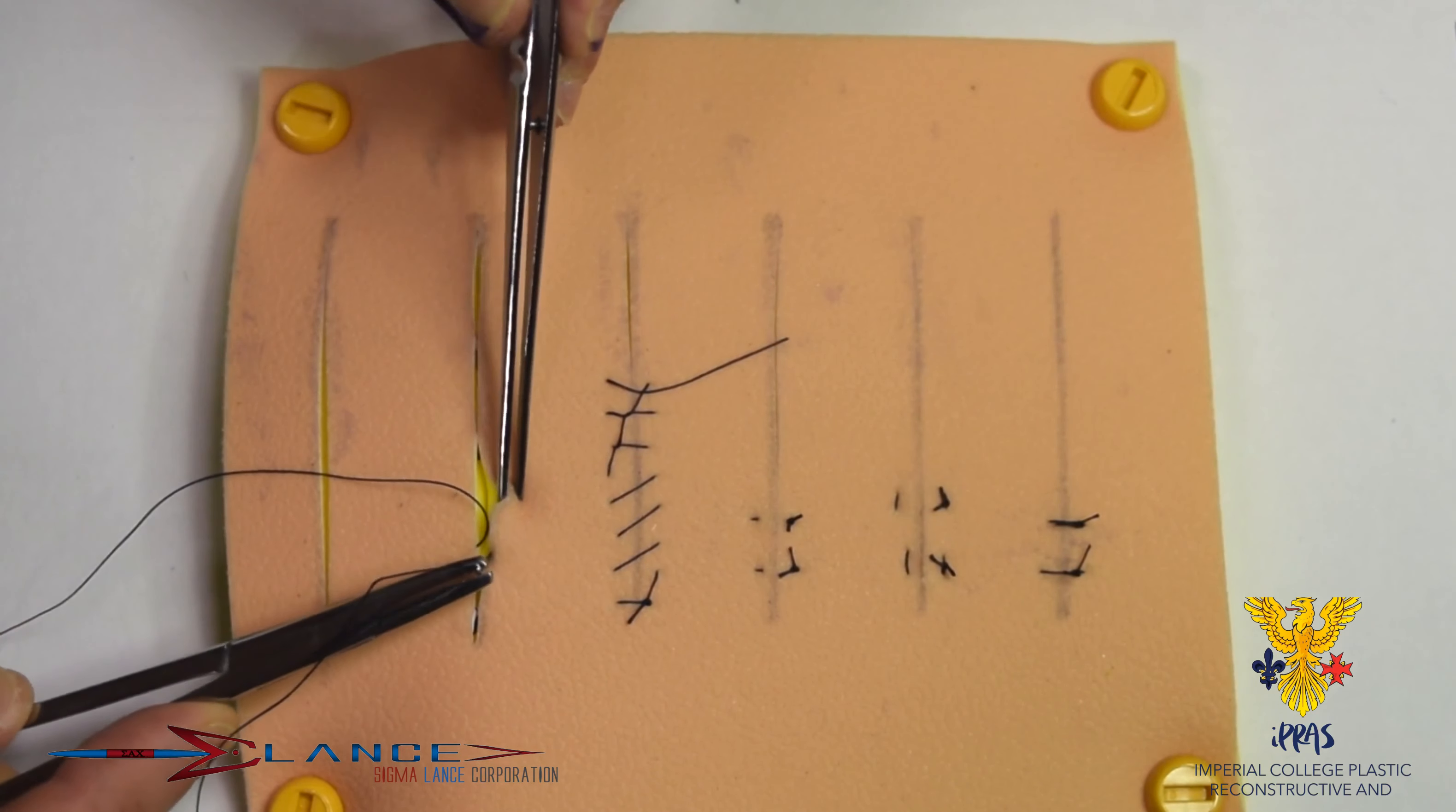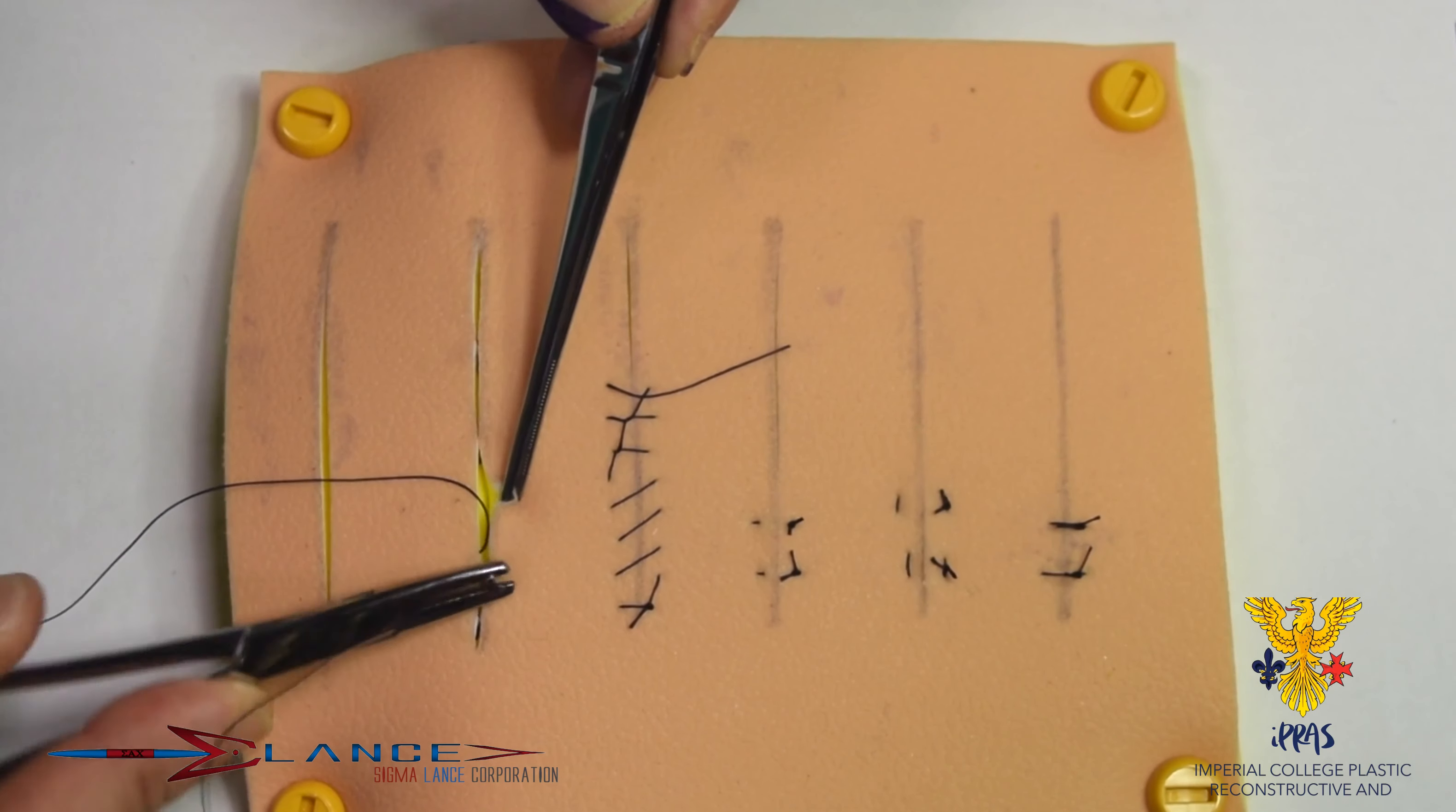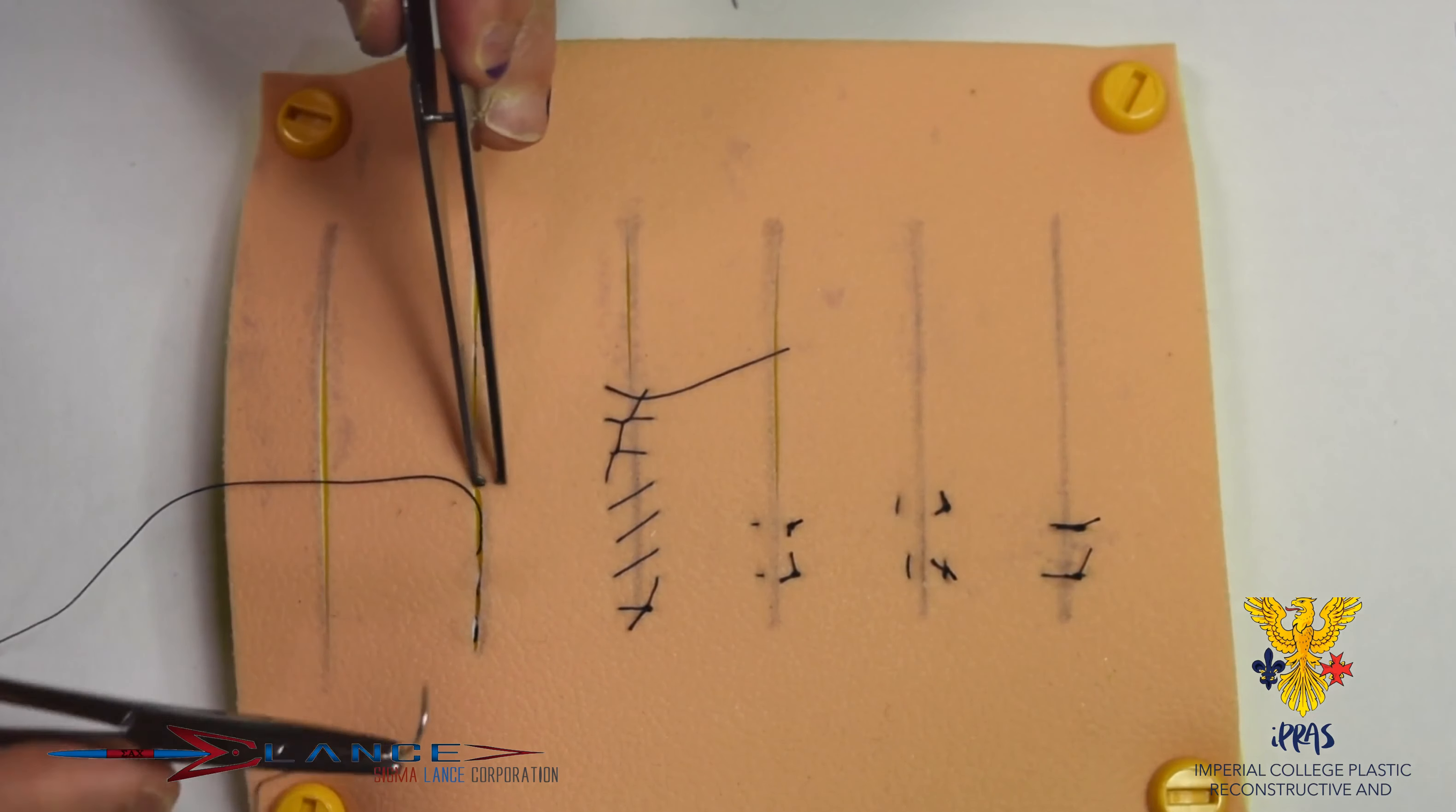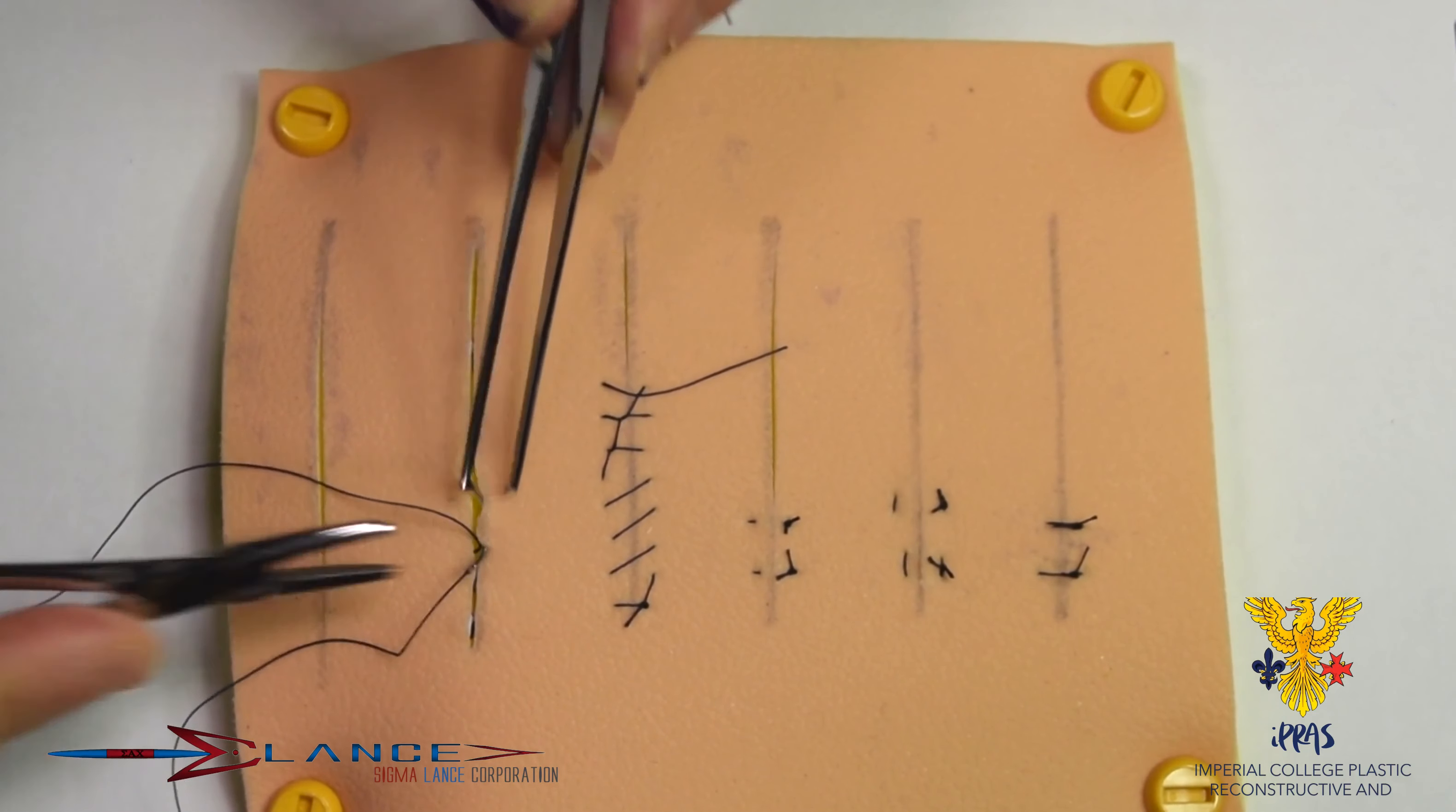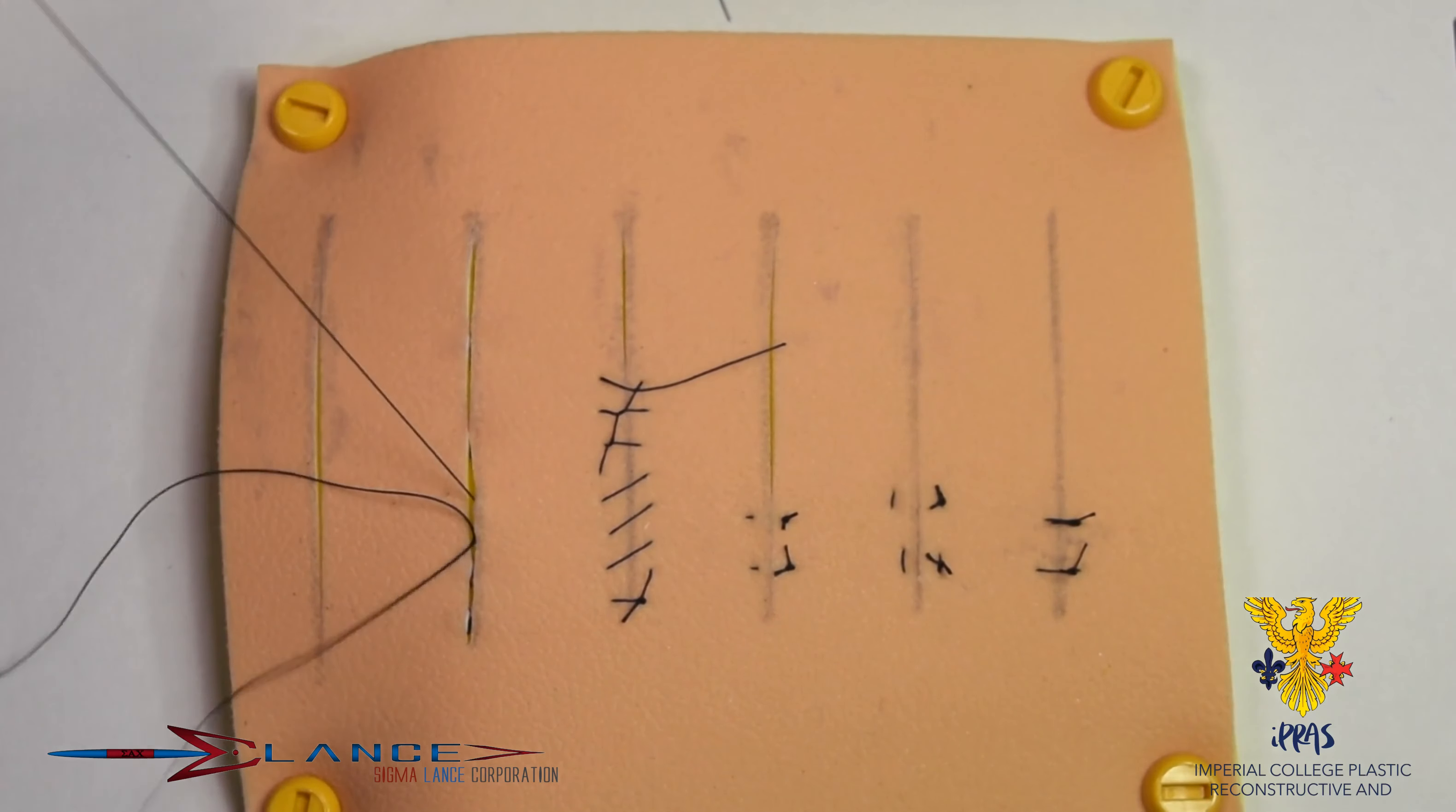So just, I need to hold this toggle a little bit. And that's where it needs to be, so when you go to pull it through, this will close the skin.